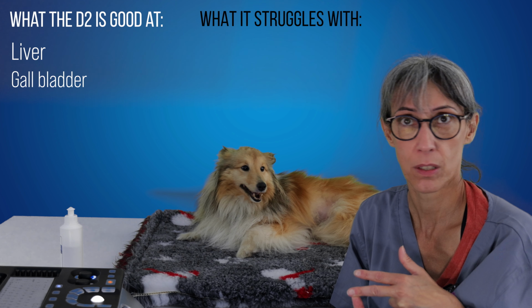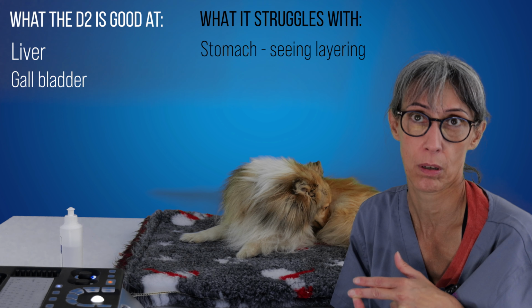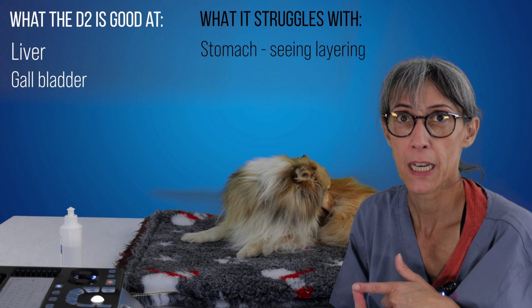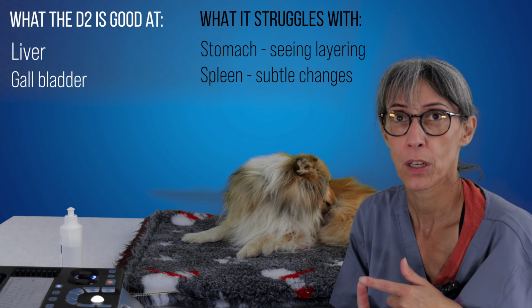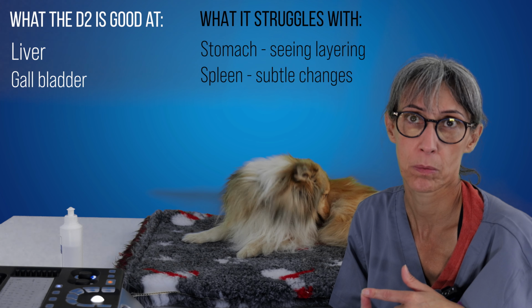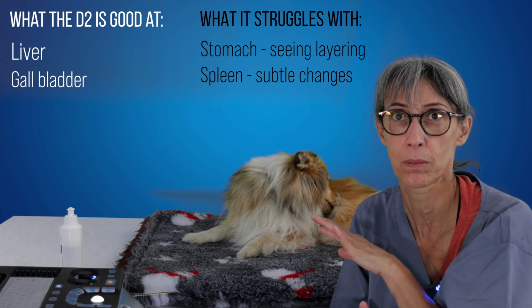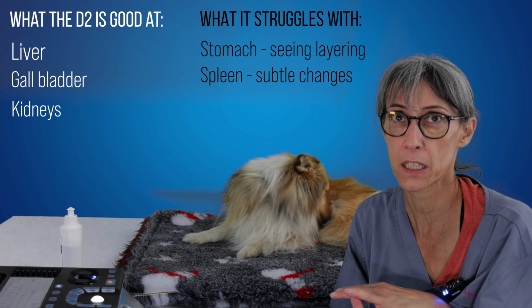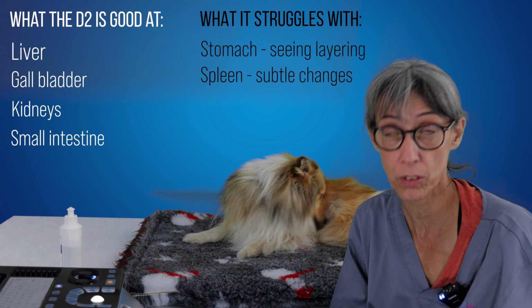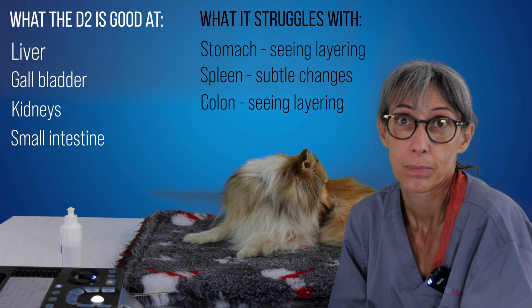Stomach, you can't see the stomach well enough, but you have an overall impression and can assess the wall thickness. The spleen, you can see it, but you're going to miss subtle changes unless you've got nodules and masses, because it hasn't got enough definition within the parenchyma in terms of the echogenicity. The kidneys are fine, small intestine is fine, the bladder we couldn't check, the colon, same as the stomach, you can see it, but you can't see the layering. Kidneys.